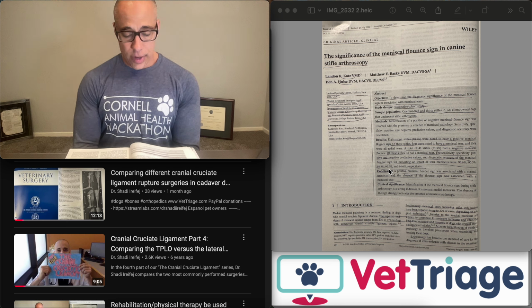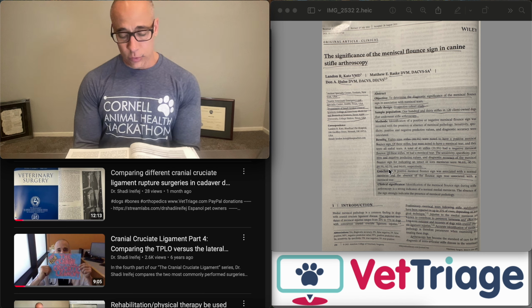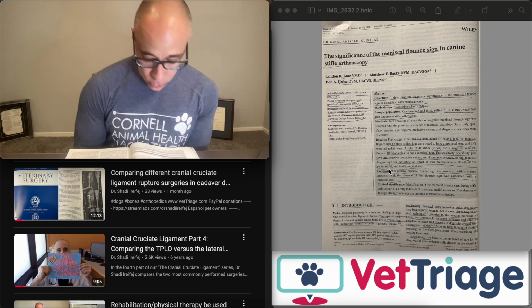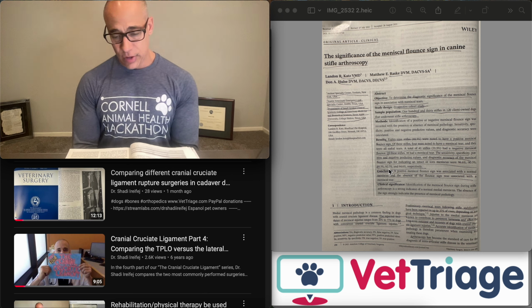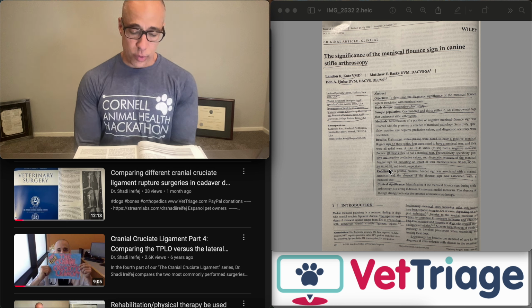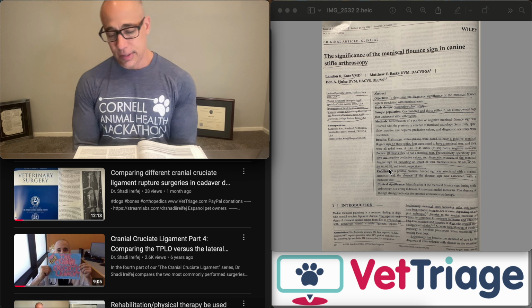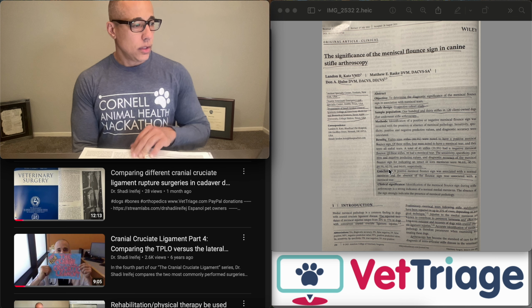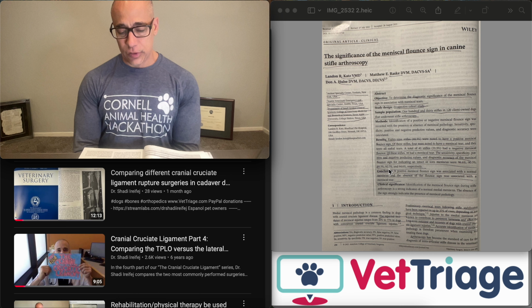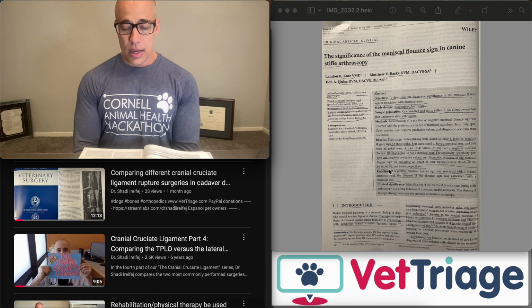Bucket handle tears were most common at 73.8%. The remaining tears were either vertical, longitudinal, radial, or complex degenerative. Like we said before, sensitivity was 96.6%, specificity 90.5%, positive predictive value 95.5%, negative predictive value 92.7%, and diagnostic accuracy 94.6%.